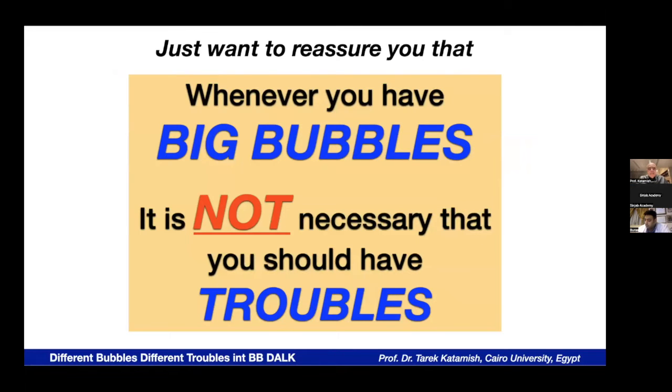At the end of my presentation, I just want to reassure you that whenever you have big bubbles, it is not necessary that you will have troubles. You may do the operation in most cases without any troubles, but you have to be aware of these troubles, because when you face them and you are aware of them, you will know how to manage them.